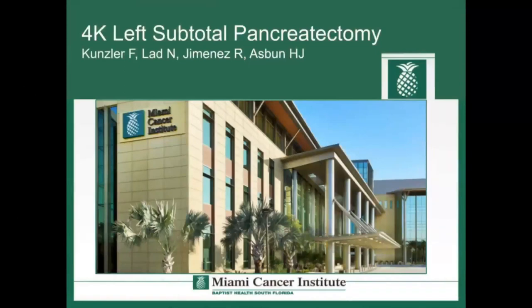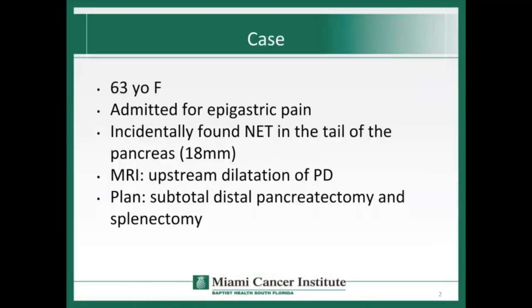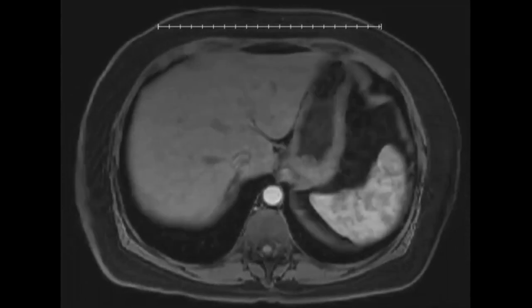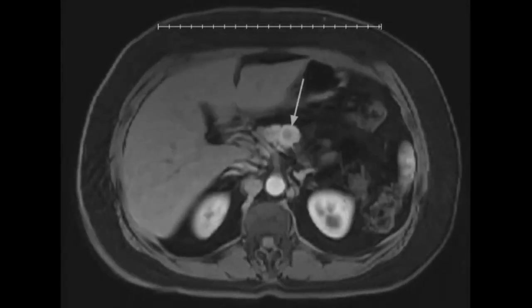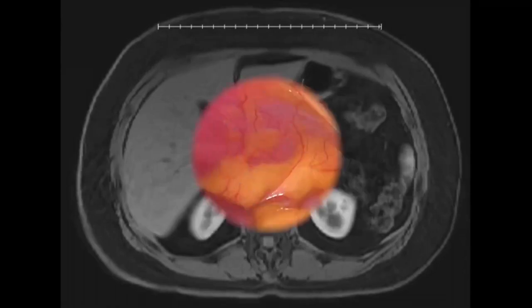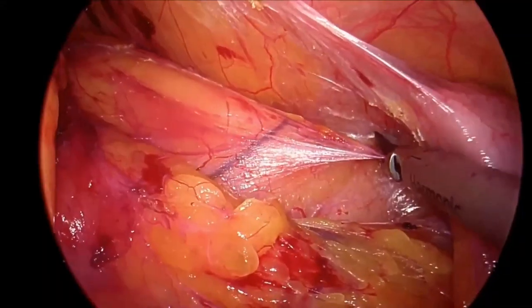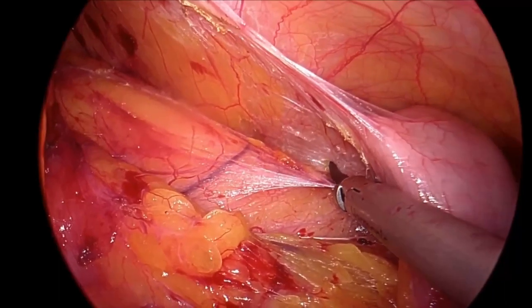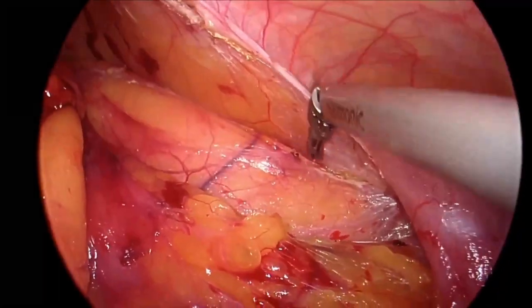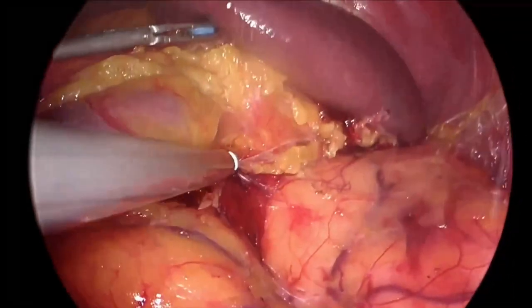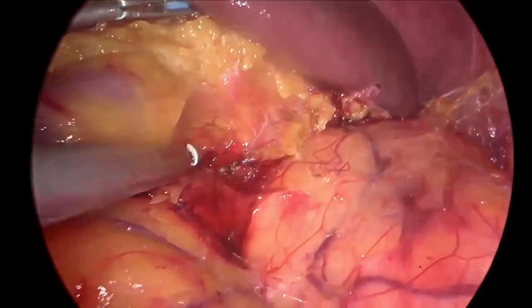We will now show a left subtotal pancreatectomy, also performed with 4K technology. The patient is a 63-year-old female with an incidentally found neuroendocrine tumor in the tail of the pancreas. The lesion caused dilatation of the pancreatic duct distally, clearly demonstrated on MRI. The procedure is started by mobilization of the colon. The patient has been placed in a modified right lateral decubitus position and a clockwise technique is used. The colon is mobilized first to aid retraction of the organs by gravity. The spleen is exposed and the dissection is carried from cauda to cephala.